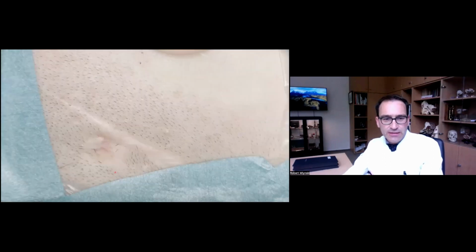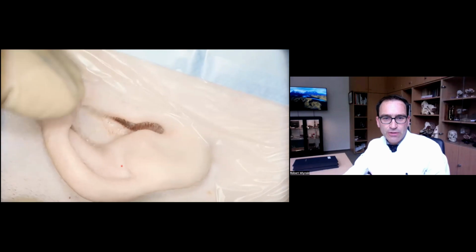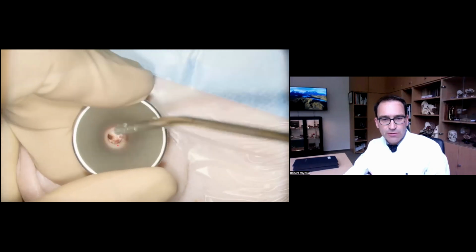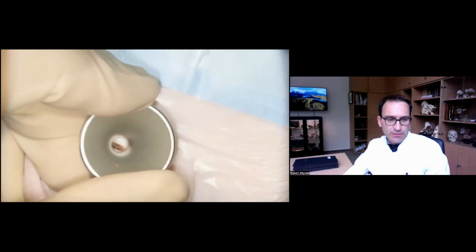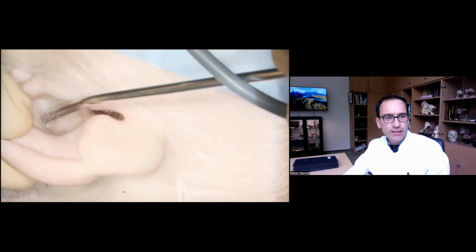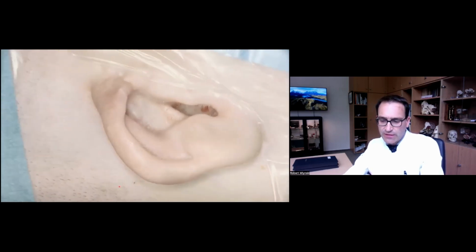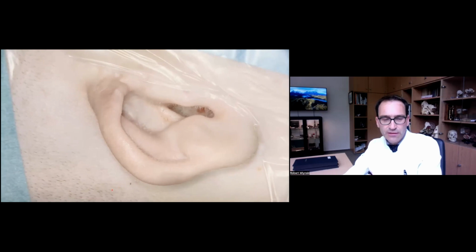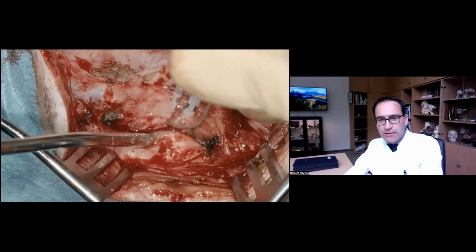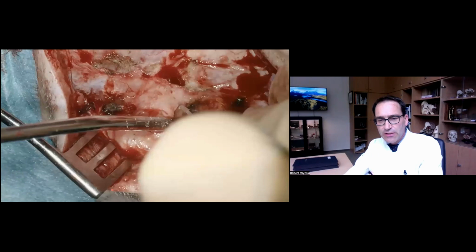So actually on the right side, the skin was overgrown on the implant, and this is the auricle with the outer ear canal, which is very narrow, and we are doing an S-shaped retroauricular incision, which is not shown in the video right now. But I just wanted to present to you what the patient looks like here. We are not using the scar or the skin incision which was used for the Baha placement. And there we now expose the abutment of the implant, which was fully overgrown by connective tissue and skin.